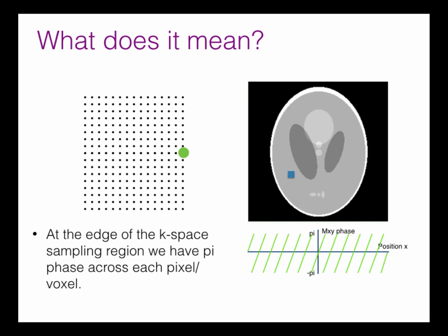Think of it like a positive lobe of a sine, and all that integrates up. Some of it's pointing off to the left and right, but it's all basically pointing forward, right? If I take the voxel next to it, it's all a negative lobe of a sine. So there's some of it pointing left and right, but all of it's basically pointing downwards.